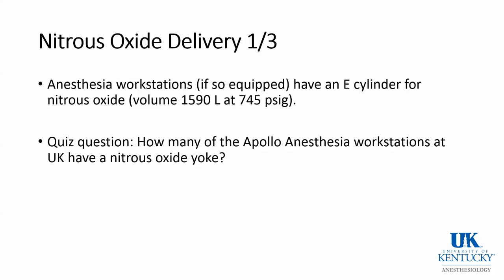Anesthesia workstations may or may not have an E-cylinder for nitrous oxide, and I encourage you to examine the Apollo anesthesia workstations at the University of Kentucky and see which ones have a nitrous oxide yoke and which ones do not.